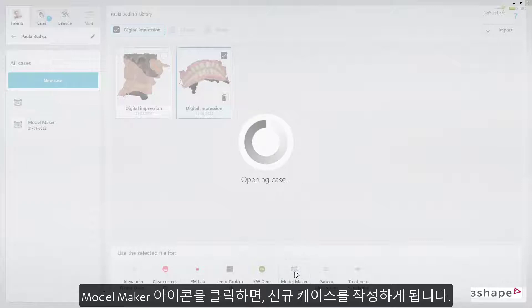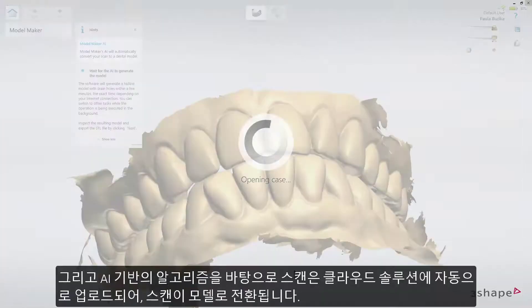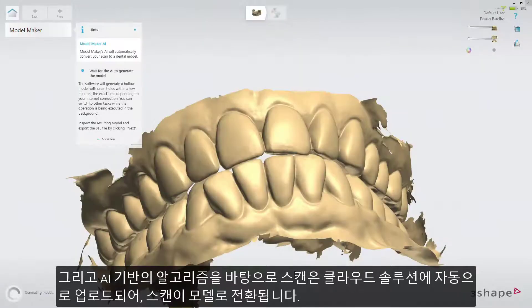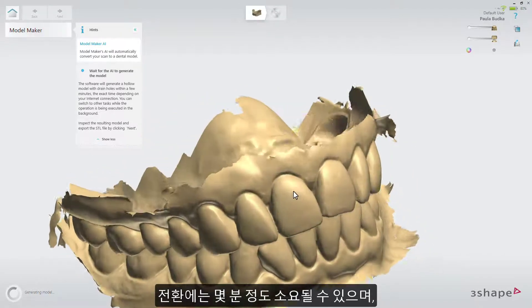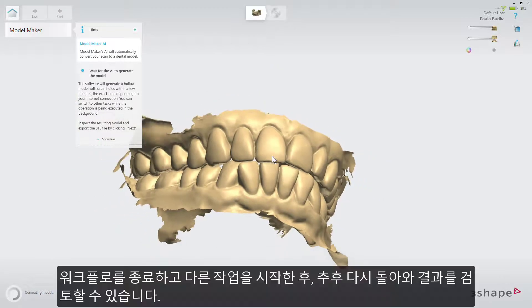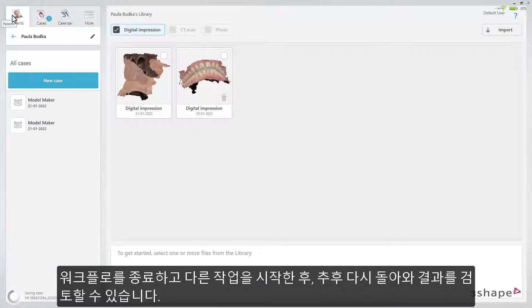When selecting the ModelMaker icon, it will start from creating a new case, and then it will automatically upload the scan to the cloud solution with the AI-based algorithm, which will convert the scans into models. It may take a couple of minutes, but you can leave the workflow to begin working on something else and come back later to inspect the results.